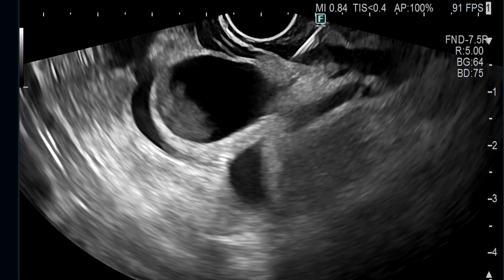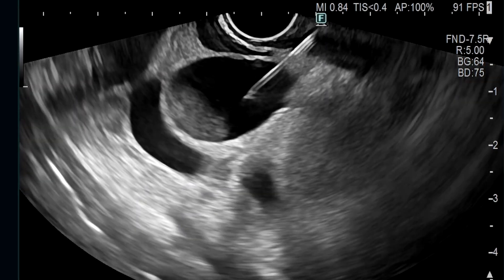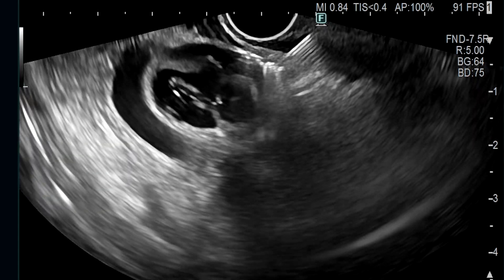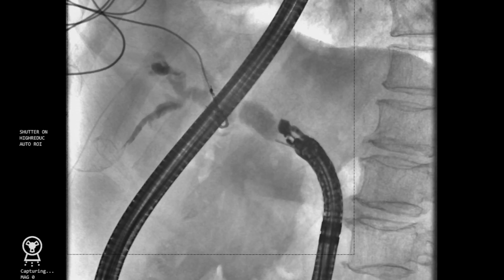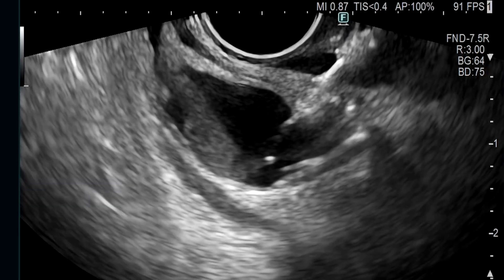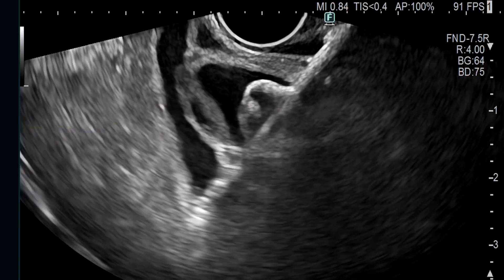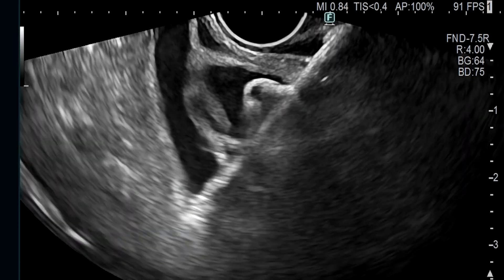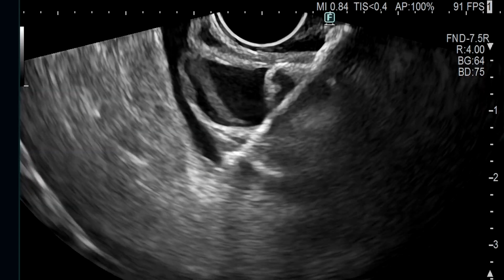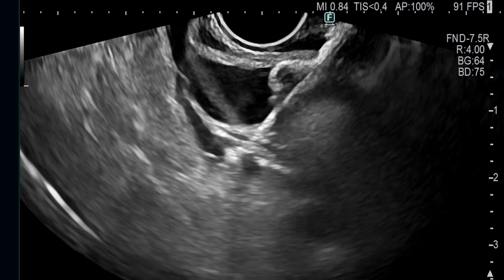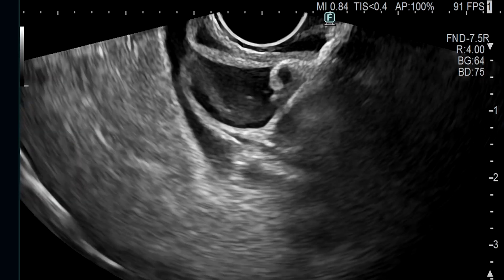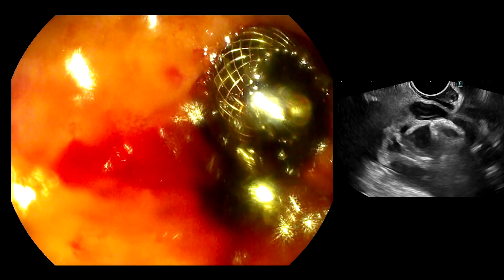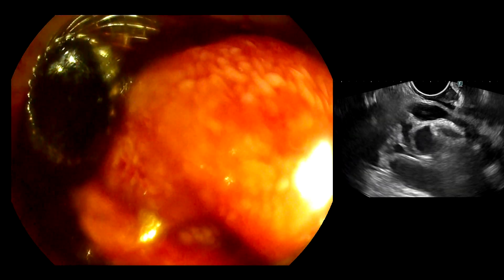A cholangiogram was first obtained by injecting contrast into the bile duct using a 19-gauge FNA needle, in order to distinguish the cystic duct from the common bile duct. The bile duct was then directly punctured from the duodenal bulb using the tip of the electrocautery-enhanced delivery system of the hot AXIOS lumen-apposing metal stent. The stent used was a 6mm diameter stent with an 8mm saddle length. After deployment of the distal flange within the bile duct lumen, the proximal flange was deployed within the scope channel and then pushed out into the duodenal lumen.